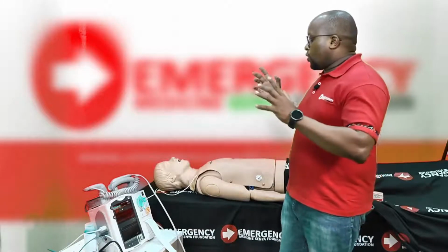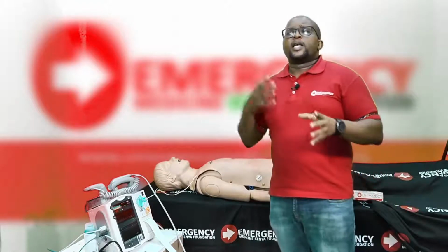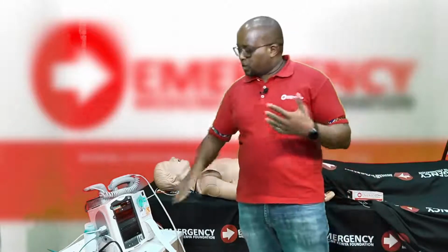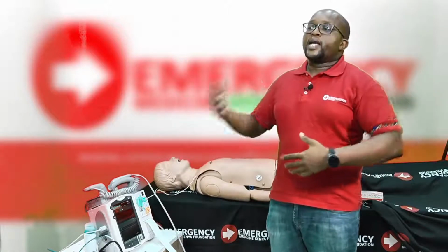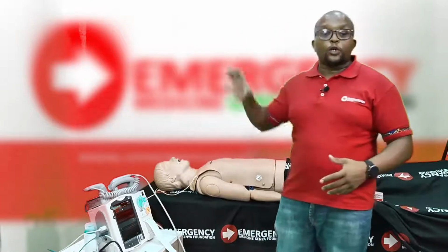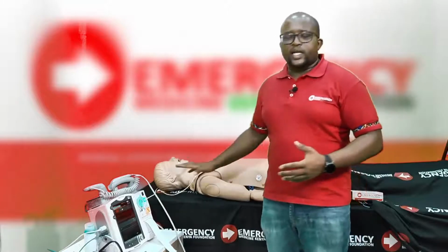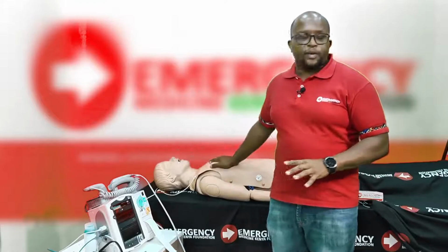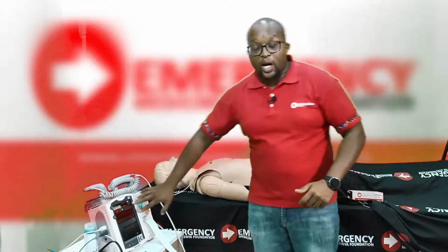So the first thing I want to do, of course, is my patient has indication. And remember, you also need to consider some of your H's and T's. Things like hyperkalemia could easily cause this, or drug toxicity. So always have this at the back of your mind: is there anything else that could be causing this very fast heart rhythm? In which case, you want to correct that before you shock the patient. Things like hyperkalemia, by giving them calcium and dextrose insulin, would easily revert the rhythm back to a normal sinus rhythm, a normal rhythm without you having shocked the patient.